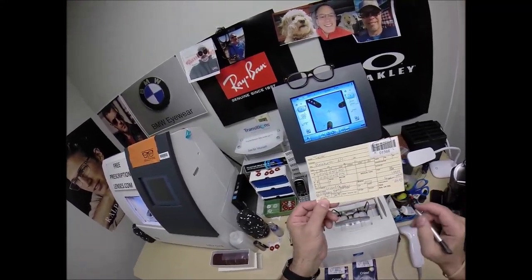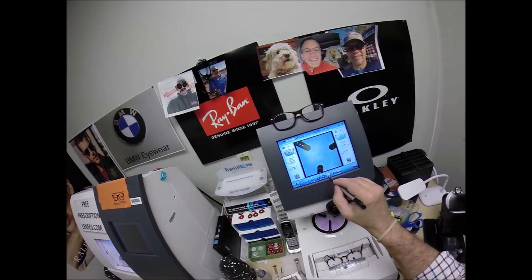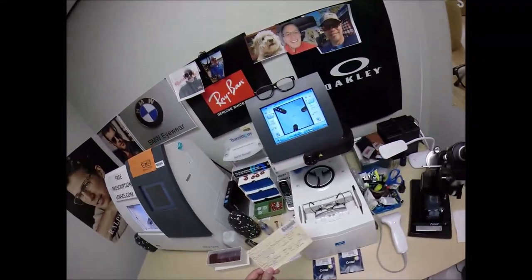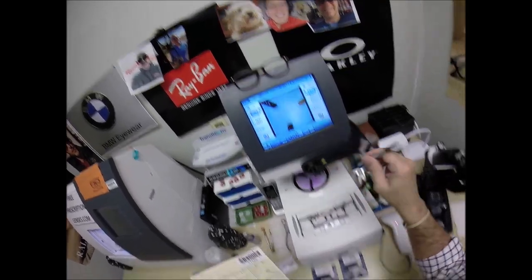I'm going to enter your pupillary distance, which is 27 for the right eye. The computer starts at 32.5, so I'm going to tap the minus button until we get down to 27. I do want to raise the optical center up to 24, because you don't look through the center of the lens. This blue cross is the geometric center of the frame, but your eye is just above that and inset inward.